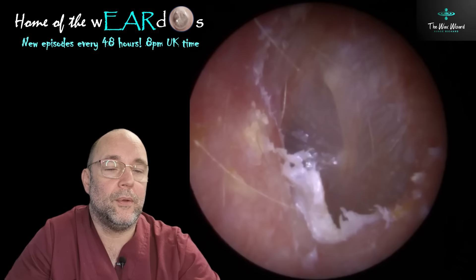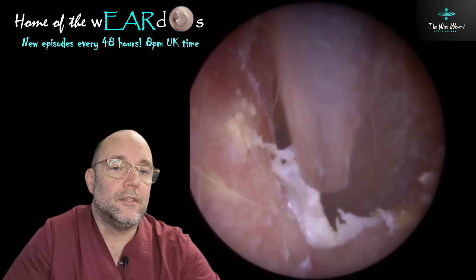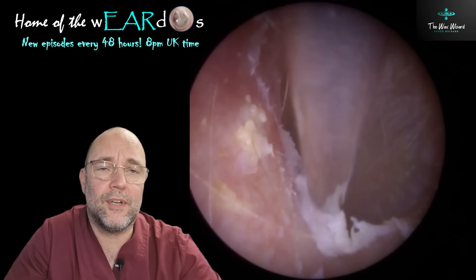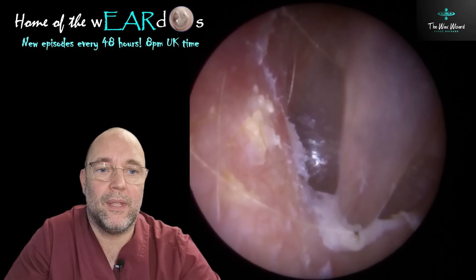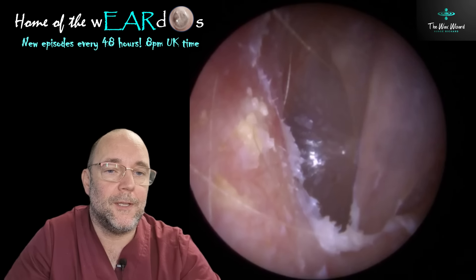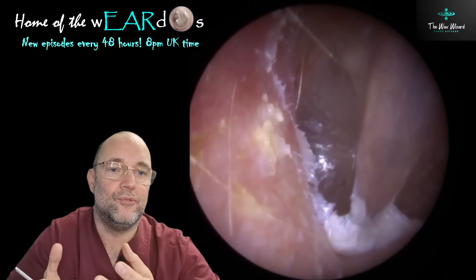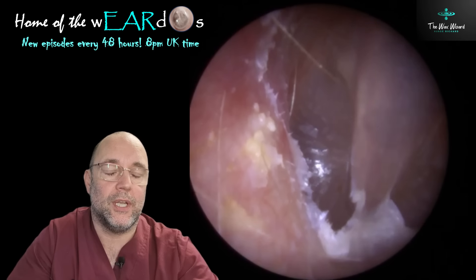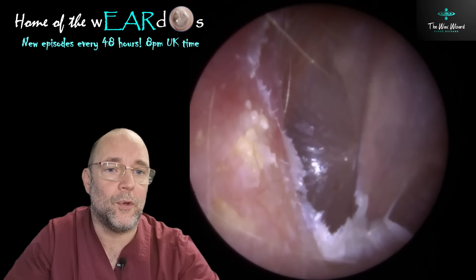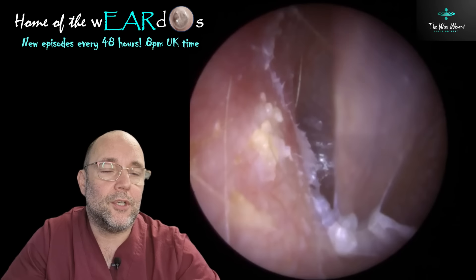Just snapping another little bit away there — not much left now. The canal doesn't look like the happiest one you'll ever see; it's a little bit pinky-red because of obviously what's been there for so long. Every time you move, eat, or chew, the jaw is always moving around a little bit, so it's constantly rubbing and causing some friction in there.